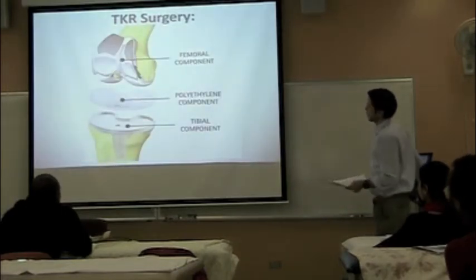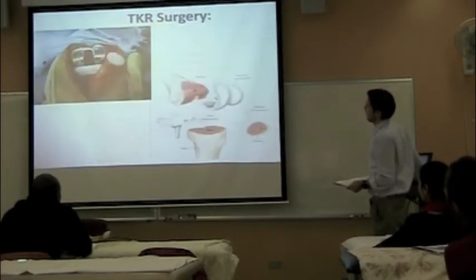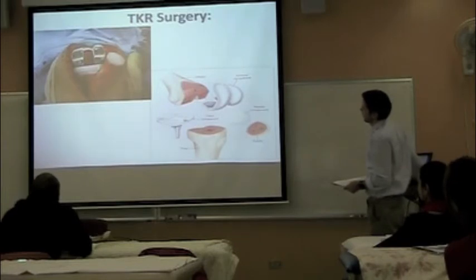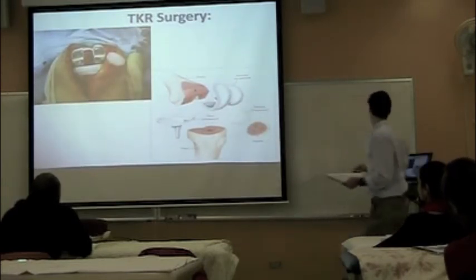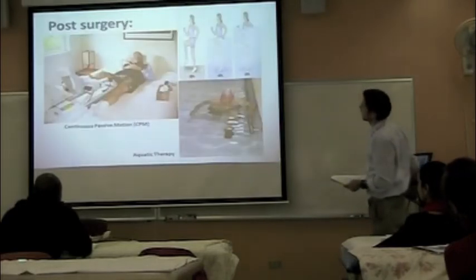There's a couple of the components, as mentioned earlier, and how they all fit together. It's quite interesting how they replace the entire inner surface of the patella. So we saw how much weight that actually bears.